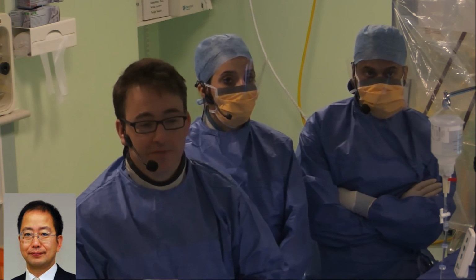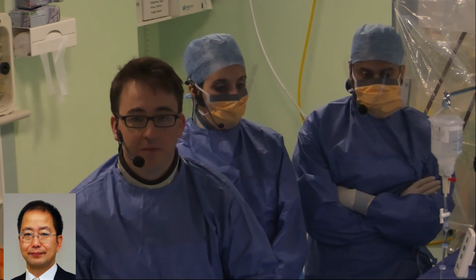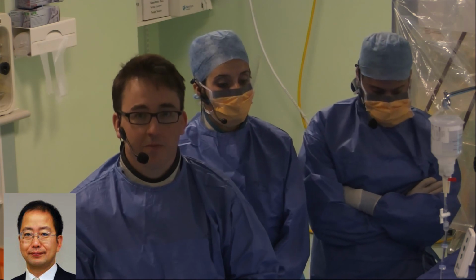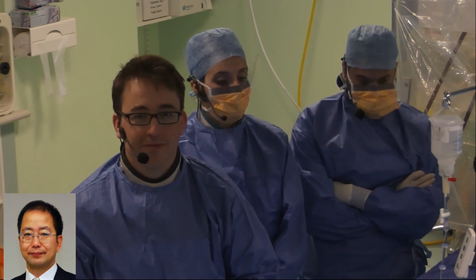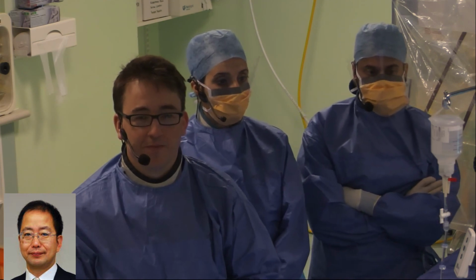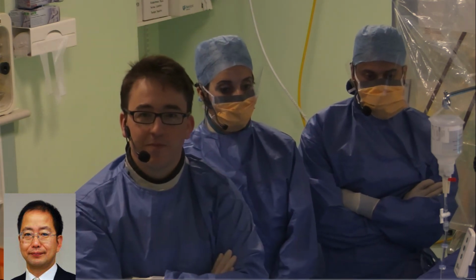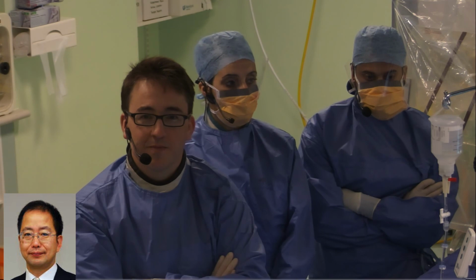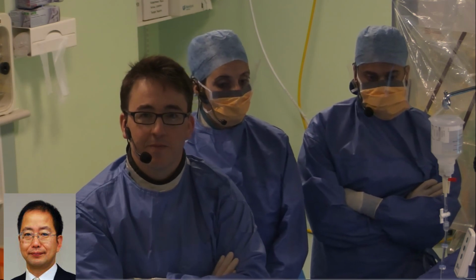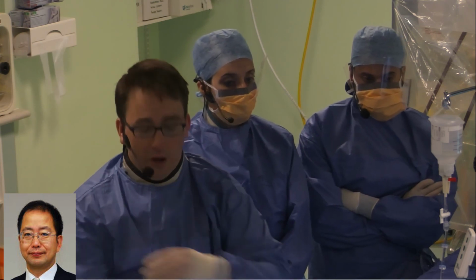I agree with you that iFR is a very sensitive value, and normalization is one of the keys to the correct measurement, right? Absolutely. So, for example, if we can't get complete normalization by two times, probably we need three or four times normalization. Is that right? I think it's unusual.